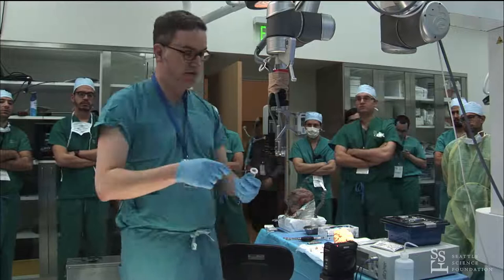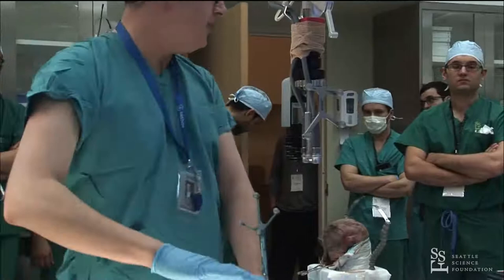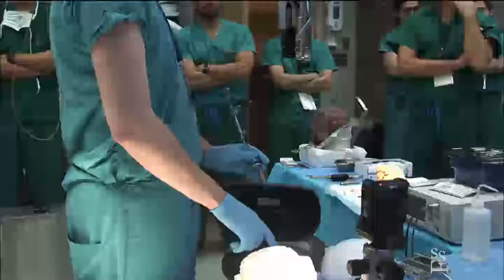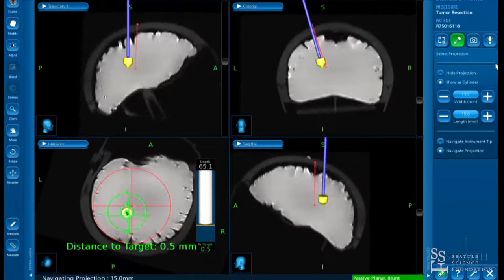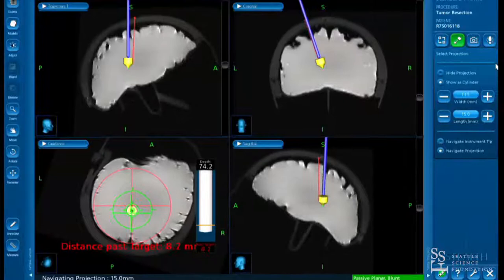It's much easier to lock the gimbal on ahead of time, then have an assistant lock it into the retractor arm while you're holding it. You introduce the trocar and follow your guidance down to target, just opening the leptomeninges without deeply exploring the sulcus. If you have your entry and target set, most systems will give you a depth to target, and once you reach it you slowly remove the trocar — it locks in — and then you start working.